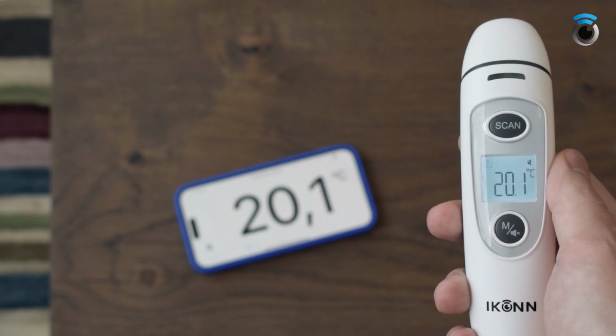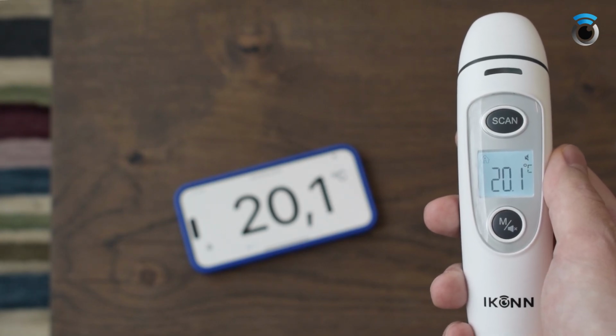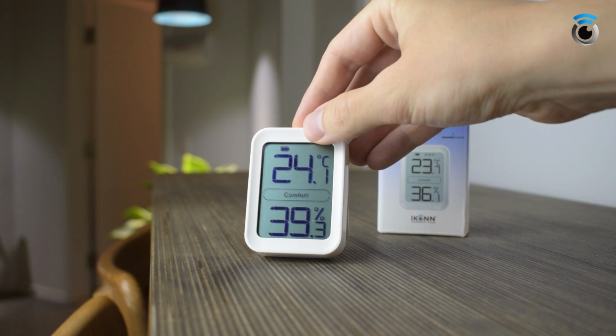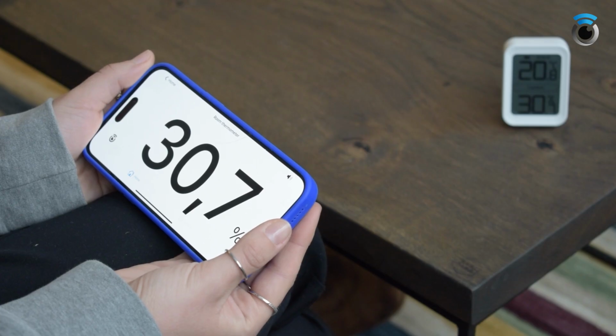Object temperature, 20.1 degrees. For some products, such as the room thermometer or blood pressure meter, there may be multiple measurements, such as temperature and humidity or blood pressure and pulse. The screen will switch between the readings every few seconds.